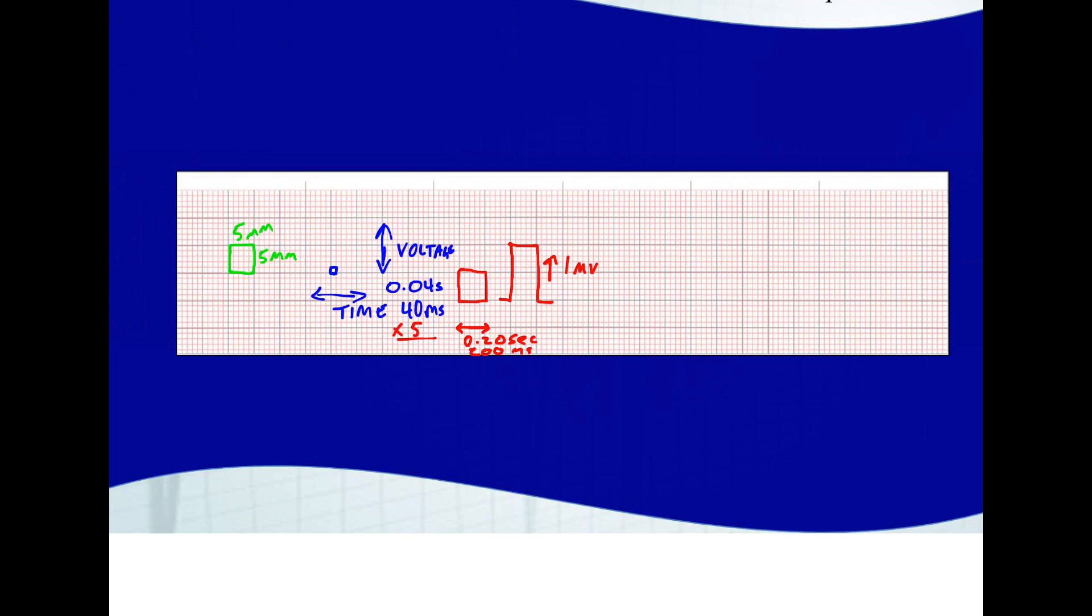If you look at these lines that come up past the grid, those are showing us every second. They're five large boxes wide. So this is one second, two, three, four, five, and six. We have six seconds for this EKG strip, and that is a very standard duration.